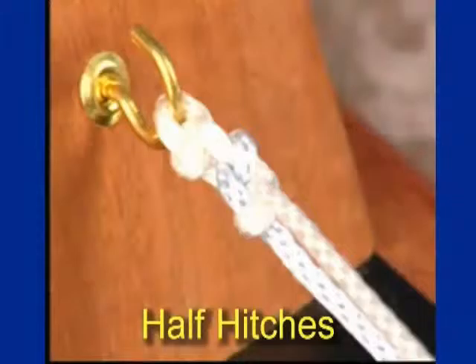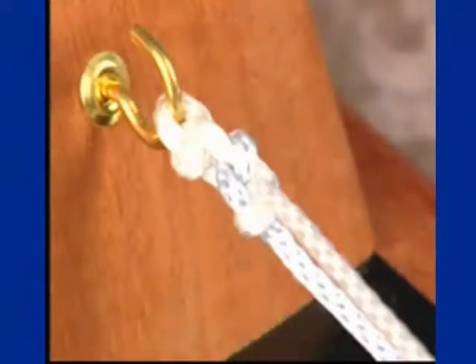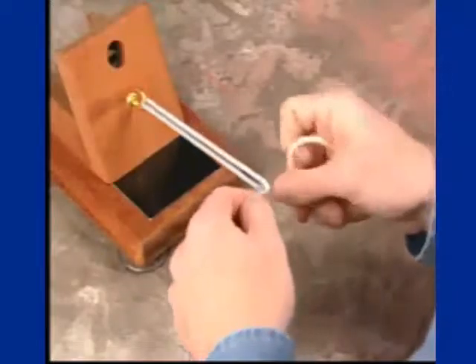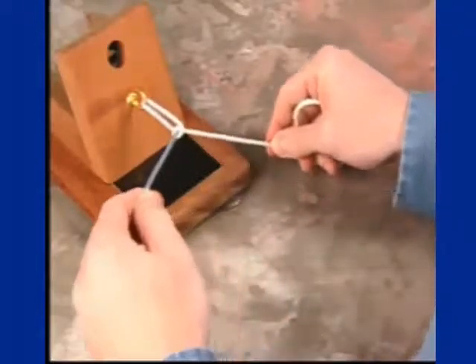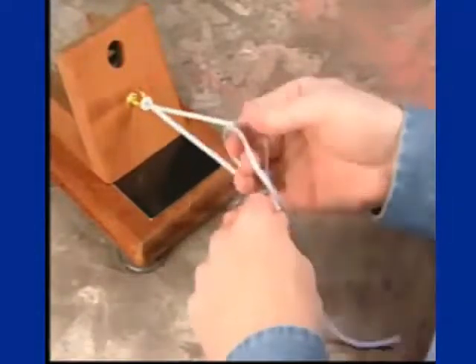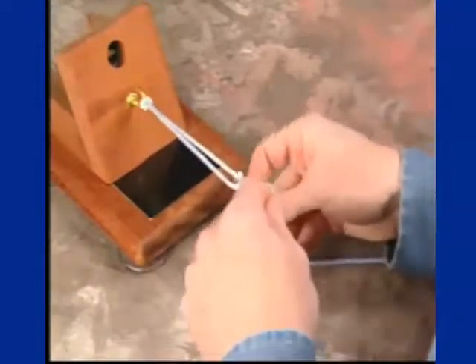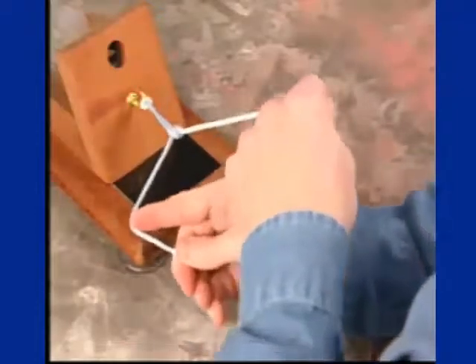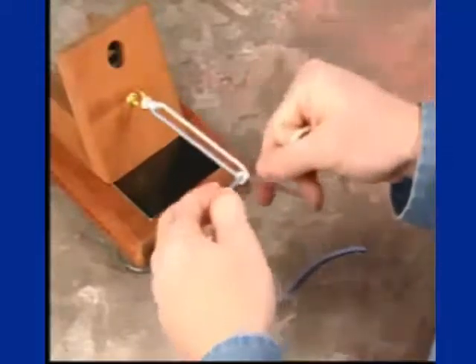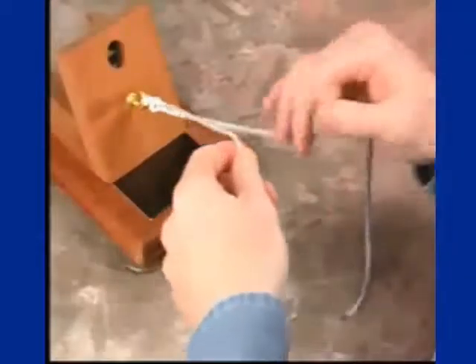This is a demonstration of the alternating half hitches, which are very important in knot tying. A half hitch is thrown either overhand or underhand, depending on the knot. Subsequently, an alternating half hitch on an alternating post is done, and slid down in the joint, securing against the first. You again alternate your post and then do a half hitch in the opposite direction from the previous.